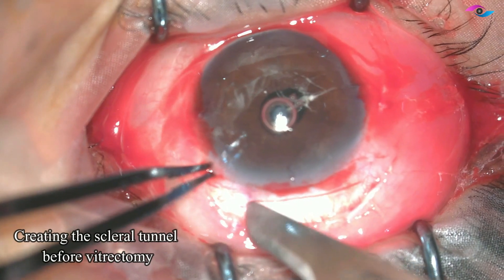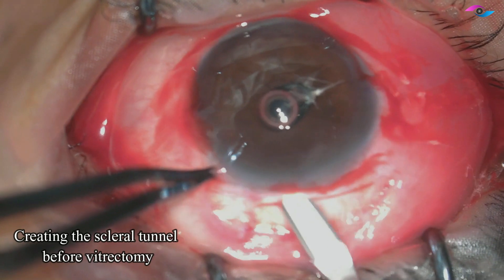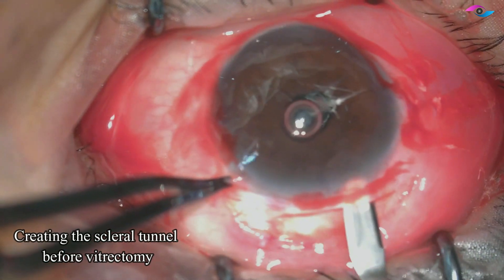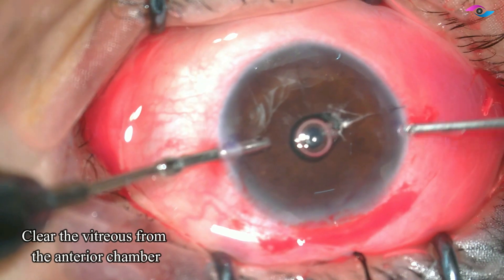Then using a crescent knife so that we can dissect the tunnel and have a well-sealing, well-opposed tunnel. Because we have not done the vitrectomy yet, the eye pressure is good and it helps in better creation of the tunnel.